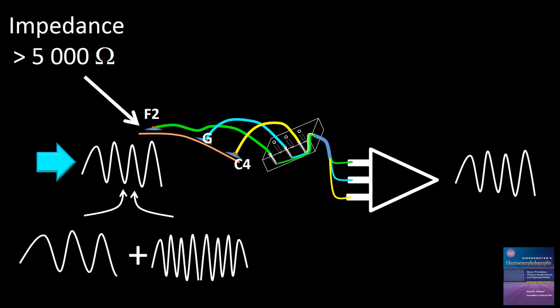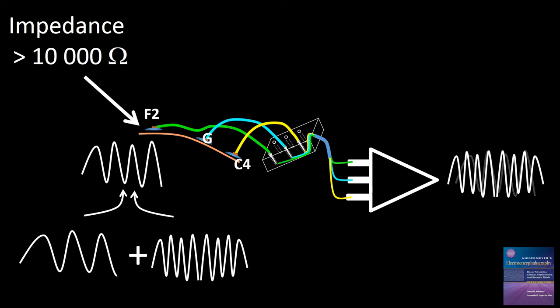If a wave at the scalp is the product of slow and fast component waves at the level of the cortex, when the impedance is low, the scalp recorded wave will display the EEG wave produced at the cortex faithfully, so that there will be a faithful reproduction of the activity generated at the brain. On the other hand, if the impedance is high, there will be a loss of low frequency components, so the monitor will show an activity that is different from the one it would have recorded if the impedance had been low, and certainly different than what it would have gathered if the electrodes were at the level of the cortex.